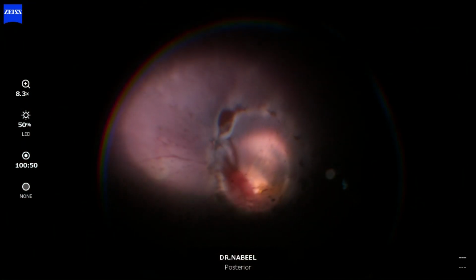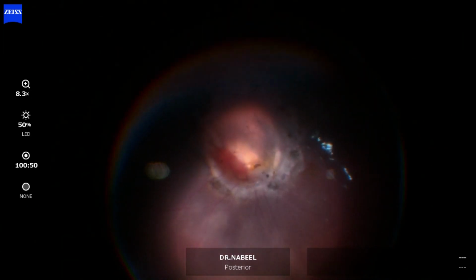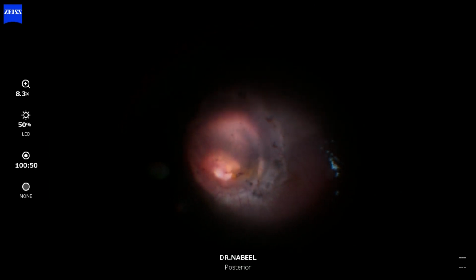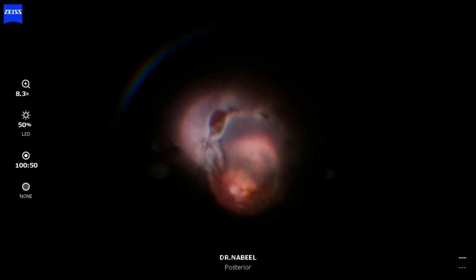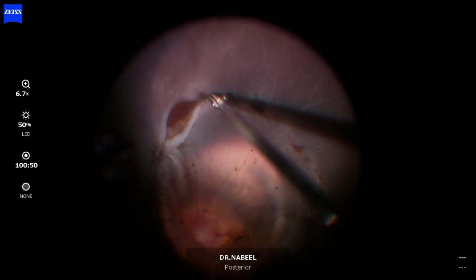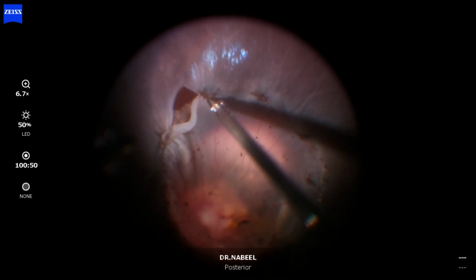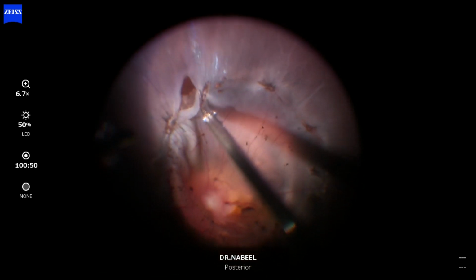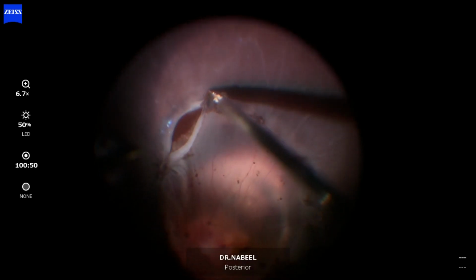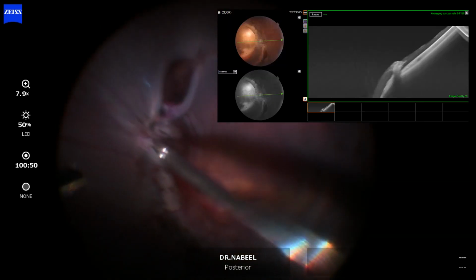After removing the cataract and the silicone oil, we can see here that there is inferior retinal detachment with ghost vessels inferiorly and hyperpigmentation at the edges of the staphyloma, and this retinal break on the inferior nasal edge of the excavation. This retinal break has fixed rolled edges. I'm trying here to peel epiretinal membranes inferior to this retinal break.